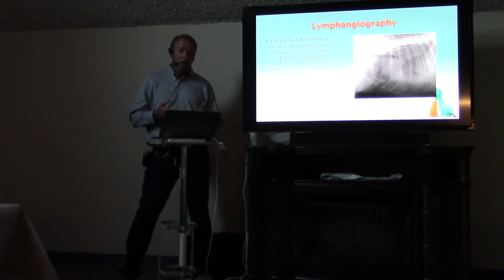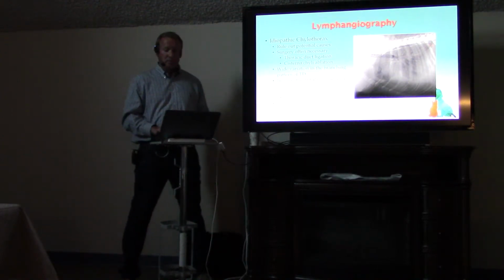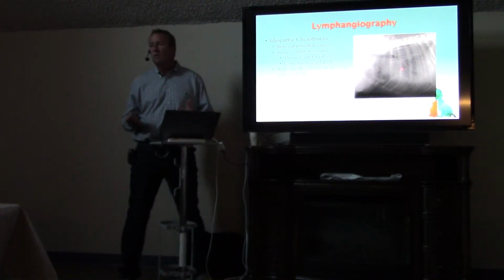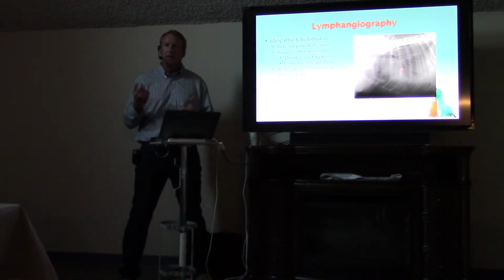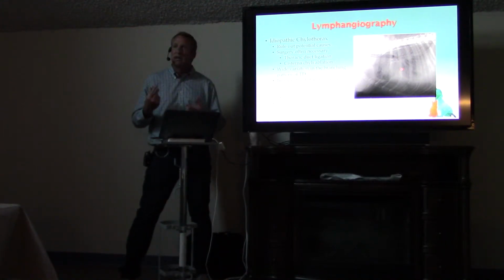having a successful outcome. And we can even do the same sort of scan after surgery to go in and make sure that, yes, all those ducts did get ligated. And this is a non-invasive procedure. It's not like we have to open up the abdomen and catheterize a lymphatic vessel or inject a mesenteric lymph node. What I like to do is I use ultrasound and I guide a needle into one of the popliteal lymph nodes and just infuse contrast into that node.